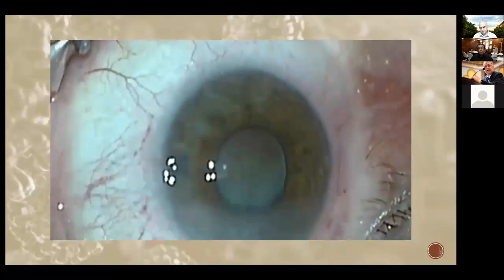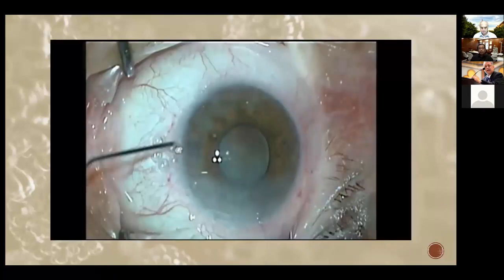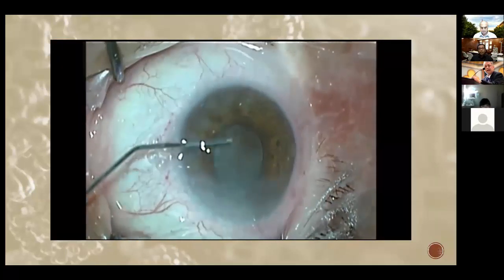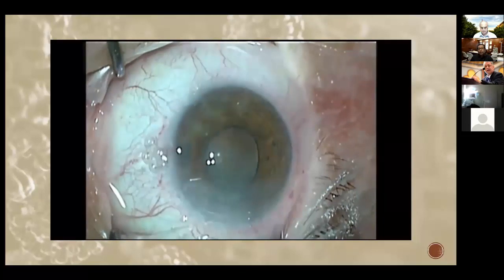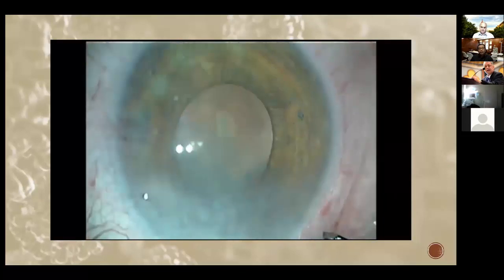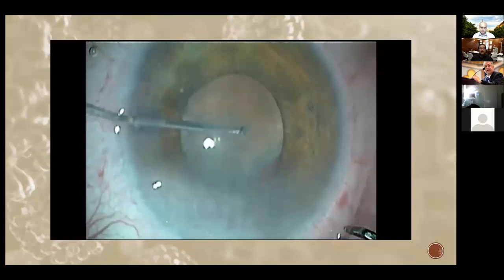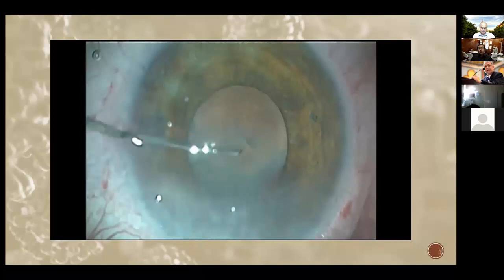Now my settings for the surgery need to be changed totally. My perception for the surgery has to be changed. Now I know that once I start emulsifying the lens, the posterior capsule is going to be directly in front of my phacotip. The rhexis. Now I want to do my rhexis from the side port, and I'm going to use my cystotome.